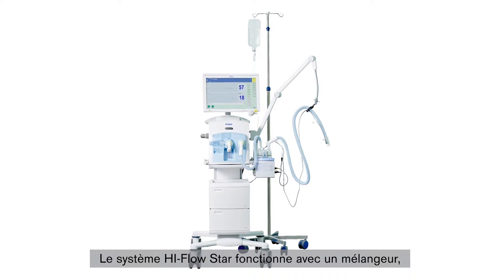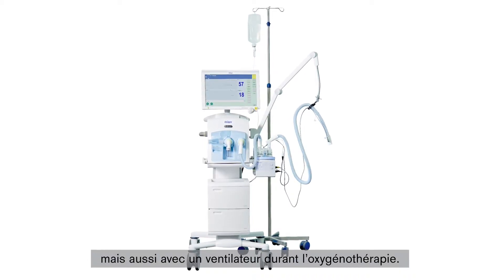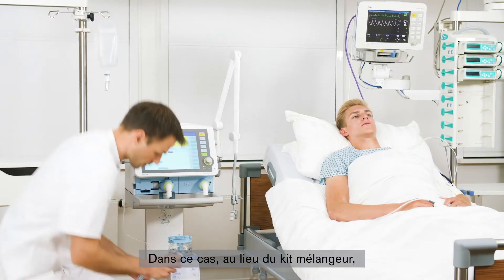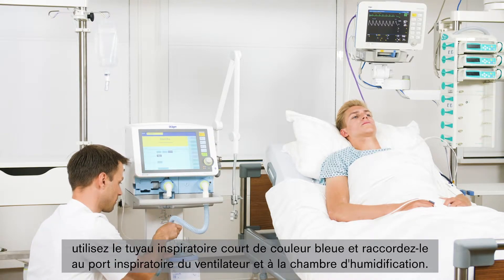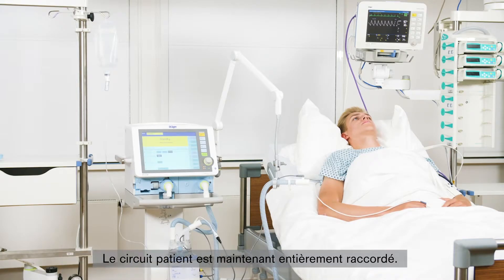In addition to use with a blender, the High-Flow STAR system can also be used during O2 therapy with a ventilator. For this, instead of the blender kit, use the short blue inspiratory hose and connect it to the inspiratory port of the ventilator and the water chamber. The breathing circuit system is now fully connected.